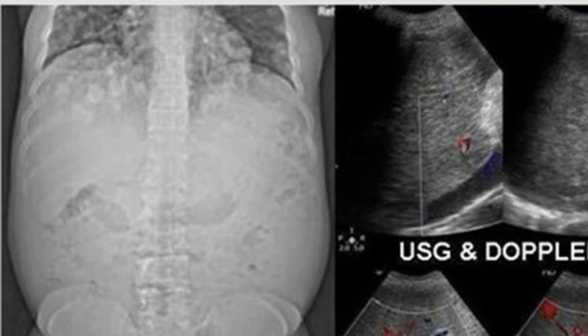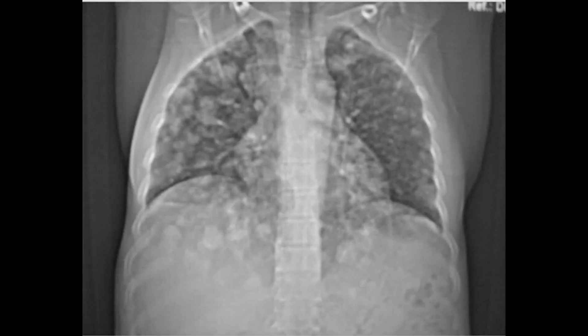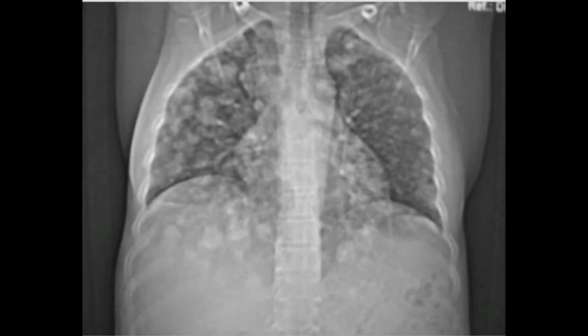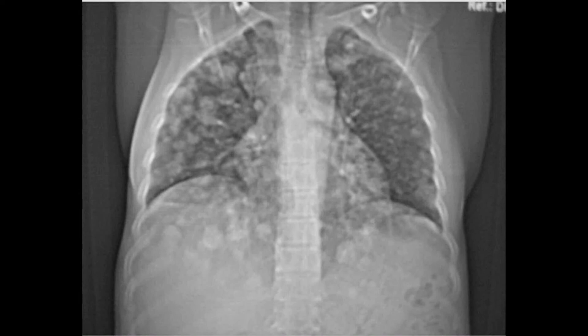In the given CT abdomen, there is no calcific pattern in the liver — just a multinodular mass. In addition, you can see the CT chest topo here, which shows multiple nodules in both lungs. So the final diagnosis is hepatocellular carcinoma with IVC thrombus giving metastatic nodules in both lungs.